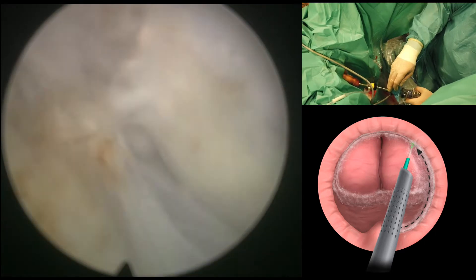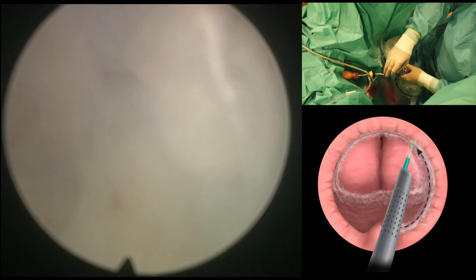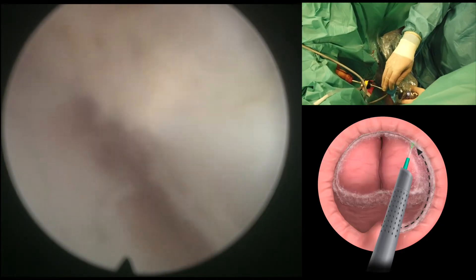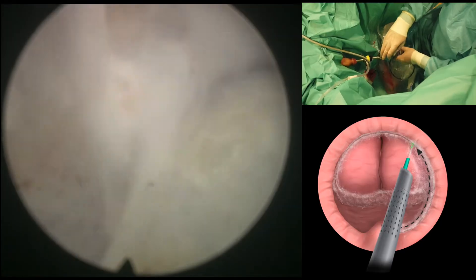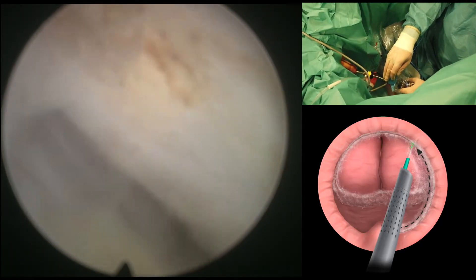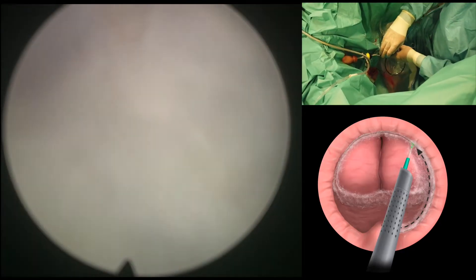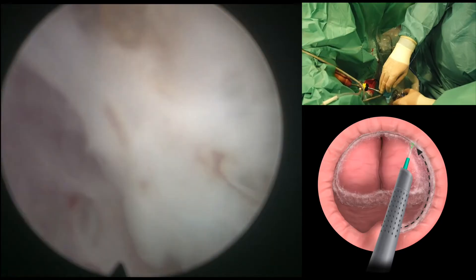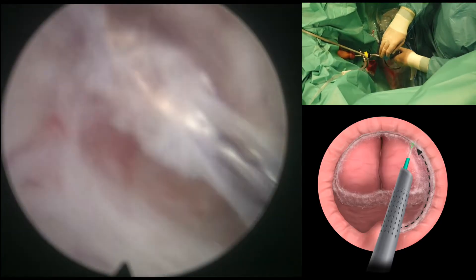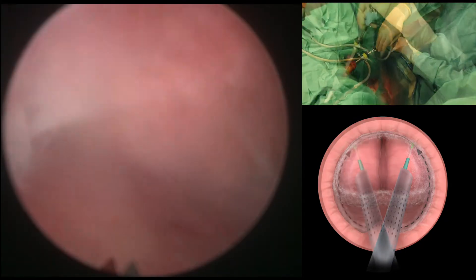It is a very nice advance in the technology of the consoles that provides excellent first-pass coagulation and excellent cutting properties, so it has enhanced the properties of the laser we use for HOLEP.